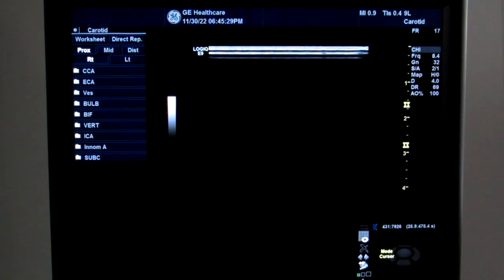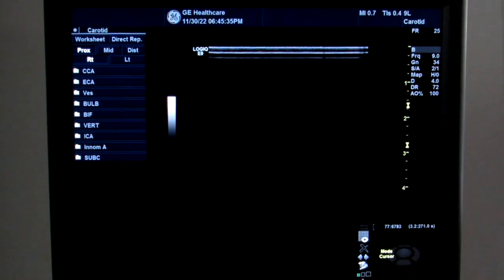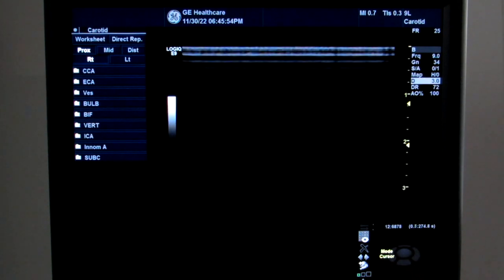Now I'm going to change it into QA settings. The first thing I'm going to do is turn off harmonics, then turn off compounding, and on this system I've got something called SRI which I'm going to turn down to zero. Then if I need to adjust the frequency, if it will go any higher, I'll set it to the highest fundamental frequency and I'll change the depth to magnify the reverb.